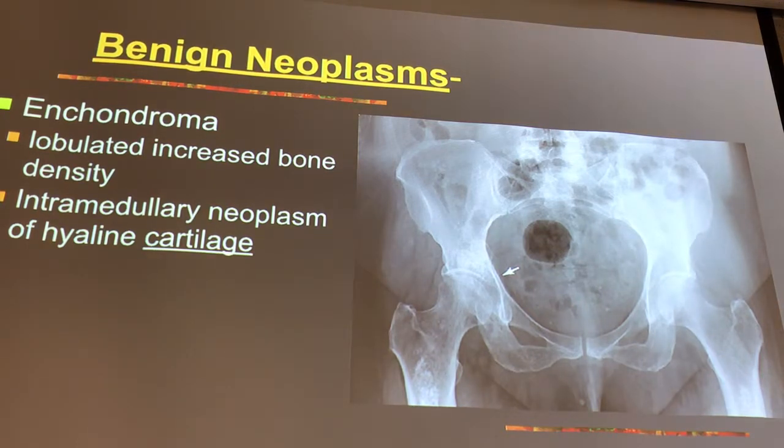So when you write out your answer, you're not going to just say no. You're going to say something in your own words about how it's so small, I don't want to affect the rest of my image. Because when you change your technical factors, you're changing the whole image, right? Now you wouldn't do this, but if you cone down to that little spot, that's all you're going to see.